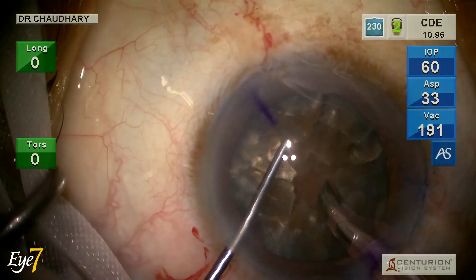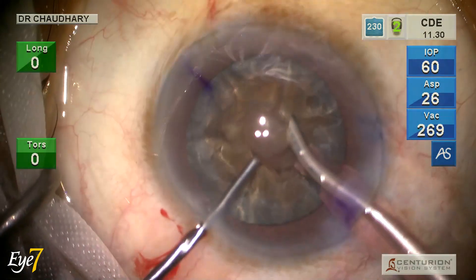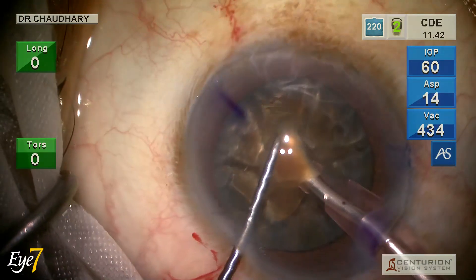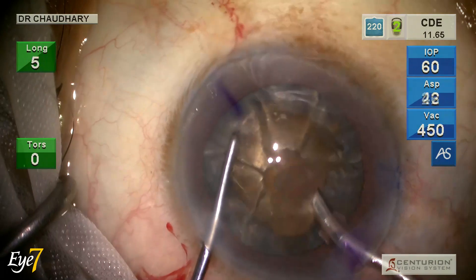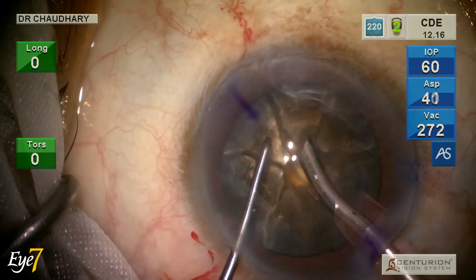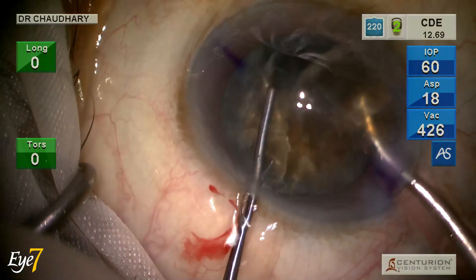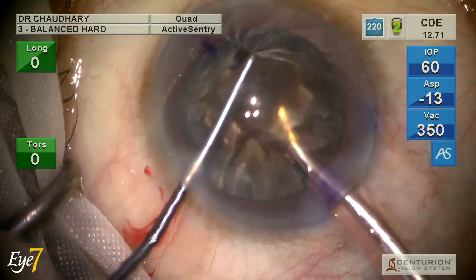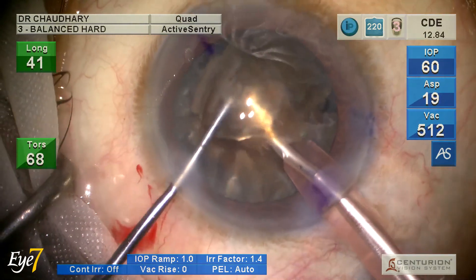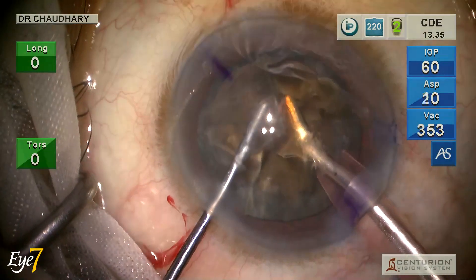Now going into foot pedal 3 — you can see on the top right corner the phaco energy is working and the CDE has become 11.42. I take out the endonucleus and then come to the pieces. The first piece is a little difficult, so I take it out in longitudinal phaco where I need a strong grip, then switch to torsional phaco for the rest of the emulsification.